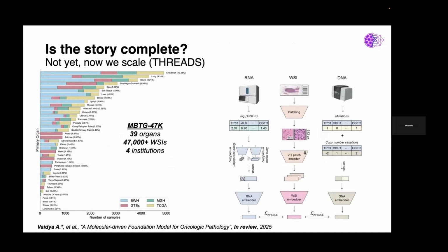Can you explain how you handle the missing modalities in your data set? So some of the data sets have transcriptomic data, some have DNA, right? So how do you do that? Yes. We were very lucky that over here, we do not really encounter the problem of missing modalities. For each of the cohorts, we have paired histology with the transcriptome or the DNA data. So when you have a slide, we're always able to contrast it with something.